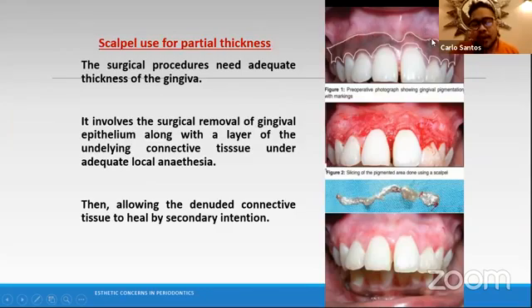The secret, guys, for the anesthesia to work, for the epinephrine to work, for your hemostasis to work, is to do it in slow motion. Inject very, very slowly, like when we instruct children to brush their teeth and they sing two songs. Don't rush it. Don't push the syringe like you're irrigating. That's very wrong. For the epinephrine to activate, you do it in slow motion. You'll be amazed that when you do your incisions, there will be no blood. So, using your 15 blade.